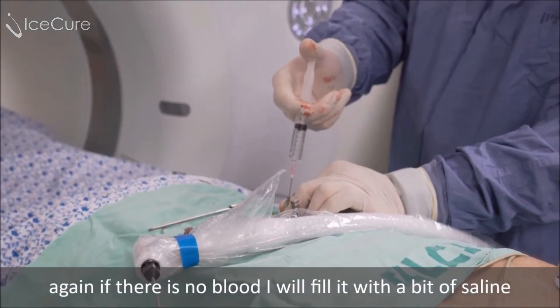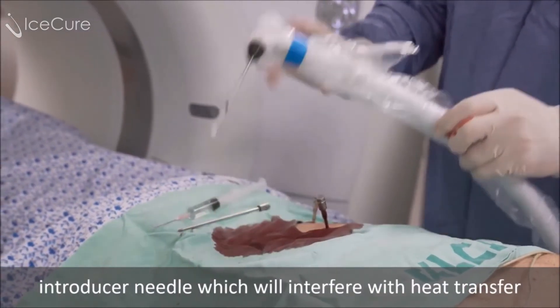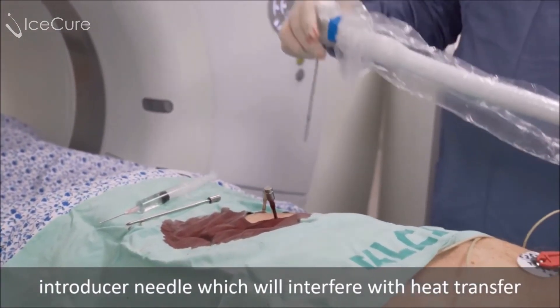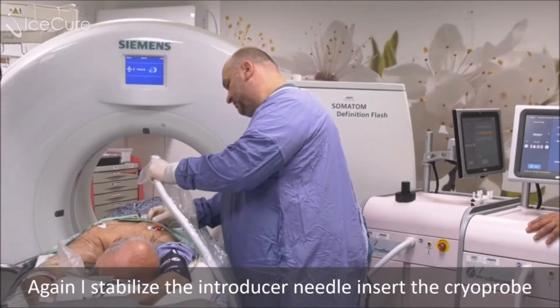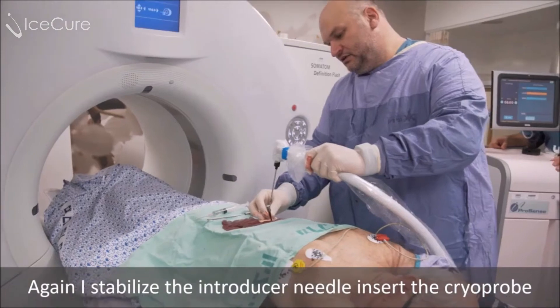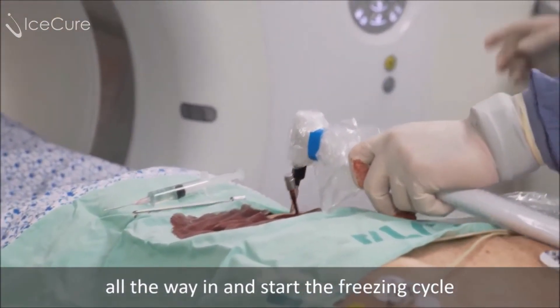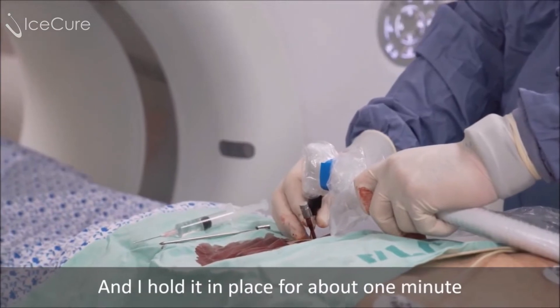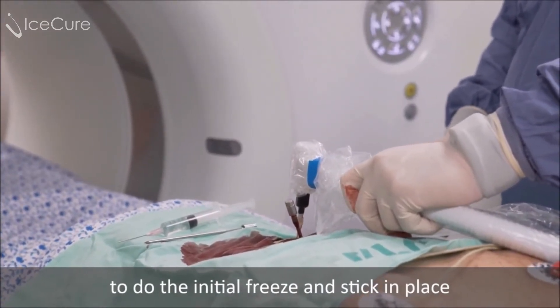If there's no blood, I will fill it with a bit of saline just to prevent air bubbles between the cryoprobe and the introducer needle, which will interfere with heat transfer. I stabilize the introducer needle, insert the cryoprobe all the way in, and start the freezing cycle. I hold it in place for about one minute for it to do the initial freeze and stick in place.